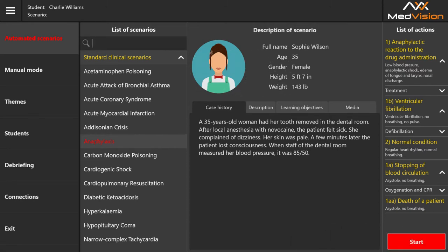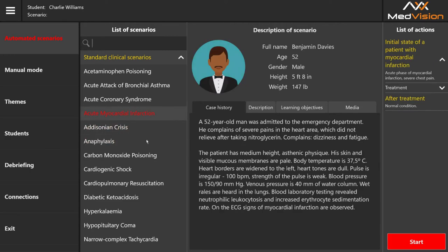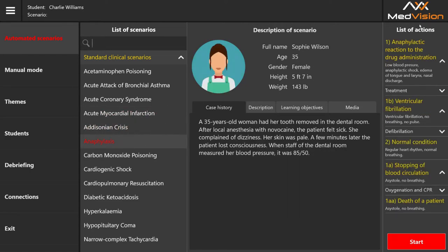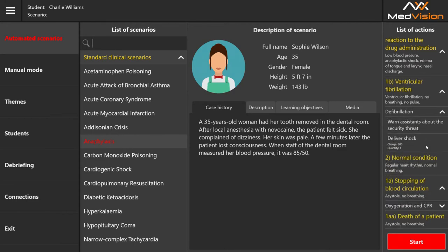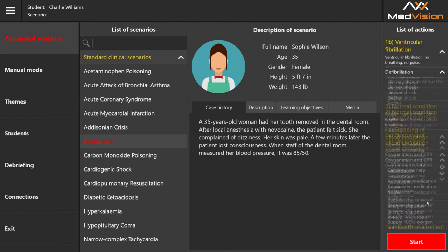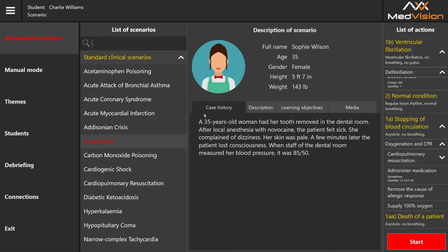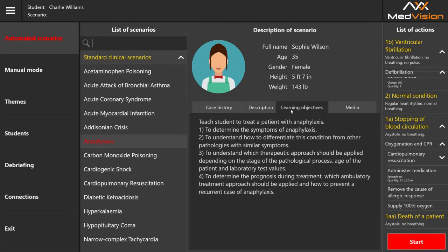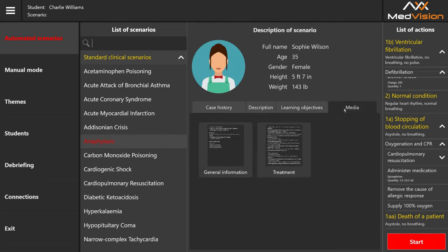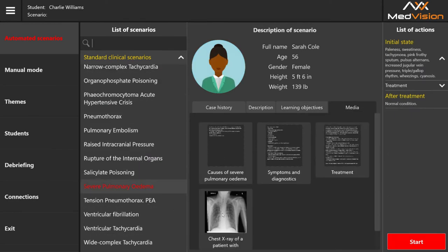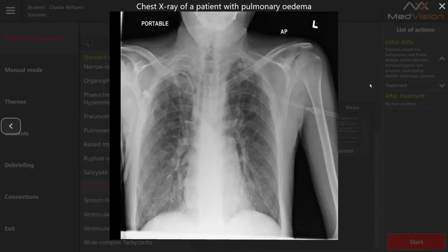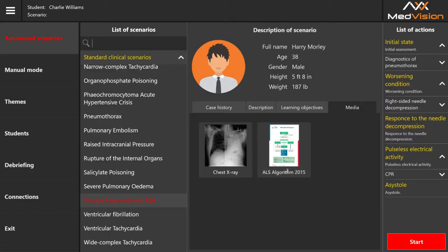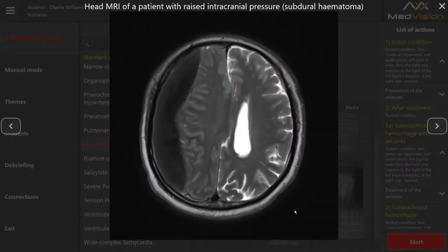There is a little icon to represent the patient — they're all very different. On the right side is a list of actions with expandable arrows to look more closely at the scenario before launching it. We also have a case history, a description of the topic, learning objectives, and media — for example a chest X-ray, an ALS protocol algorithm, and an MRI.